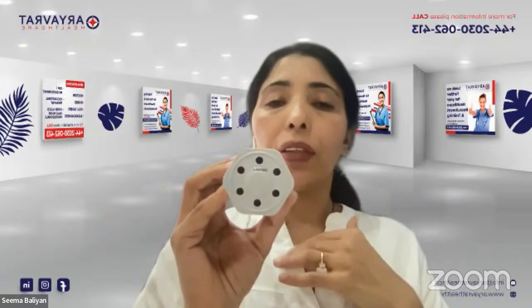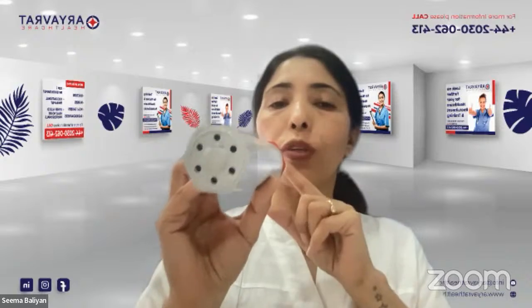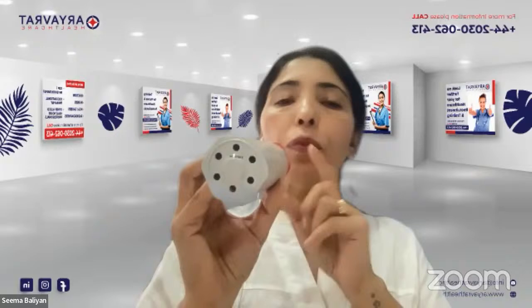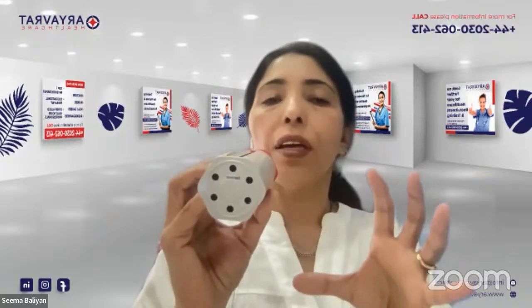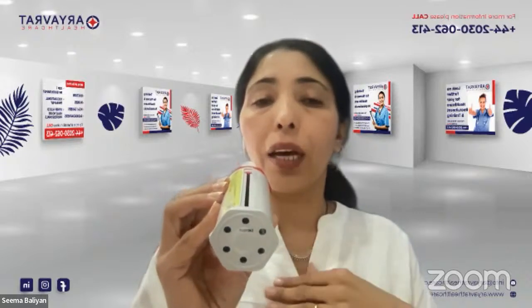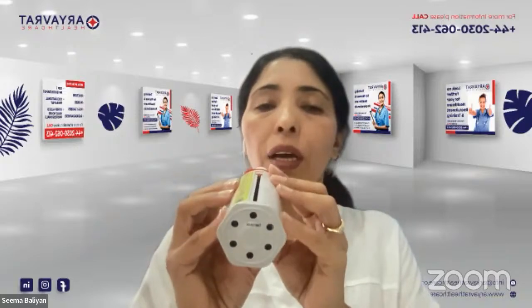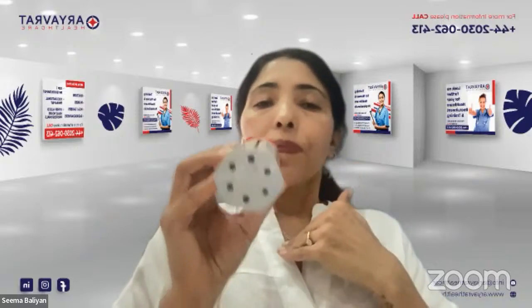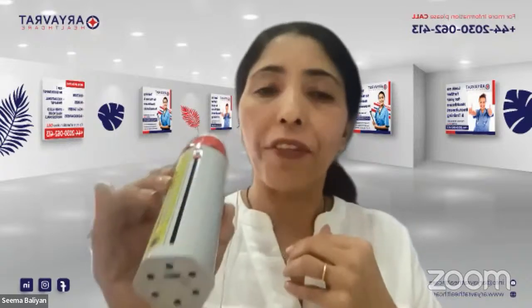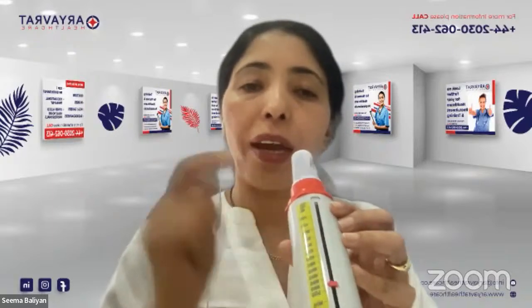And once I have done that, I will need to make a tight grip around the mouthpiece, making sure that my tongue is not blocking the mouthpiece in any way. And then I'm going to give a sharp huff and blow out all of the air which is there in my lungs. So it's going to be as if you are taking a deep breath in, making a tight grip, and then giving a sharp huff like that. The idea is to push the plunger as far as possible.